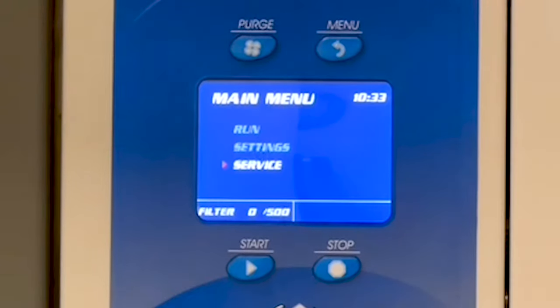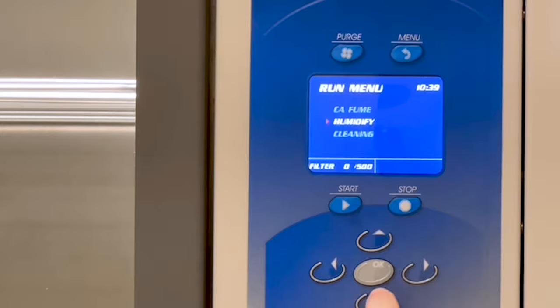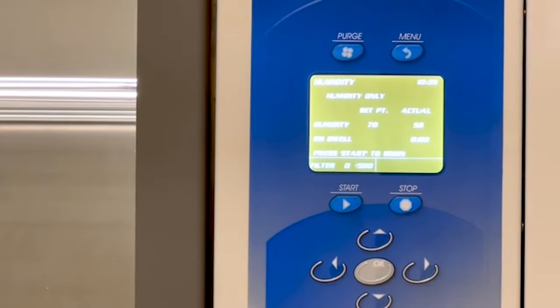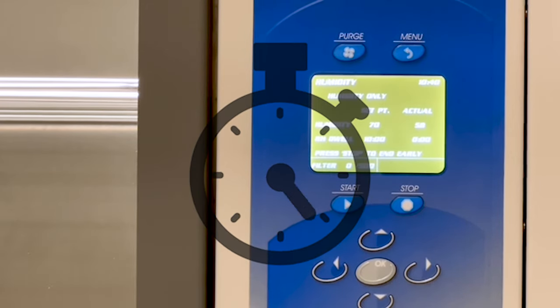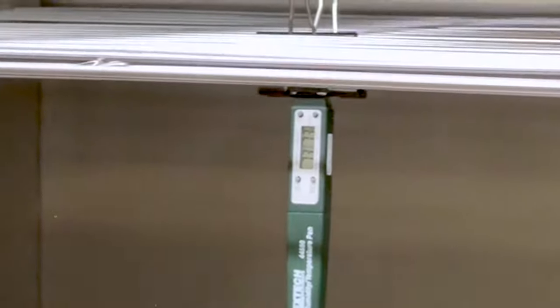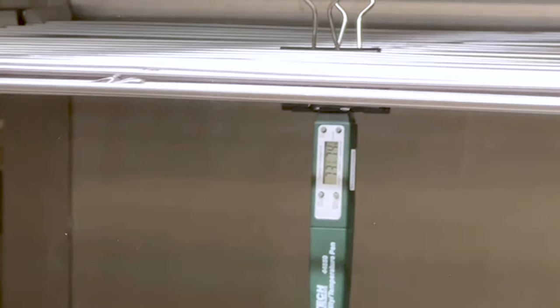Press Menu again to get to the main menu. Press OK to select Run. From the Run menu, press the down arrow to Humidify and press OK to select. Now press Start to begin the humidifying process. Once the humidity cycle is complete, verify what's displayed with the hygrometer. For a proper calibration, the display needs to be within plus or minus 5% of the hygrometer reading.